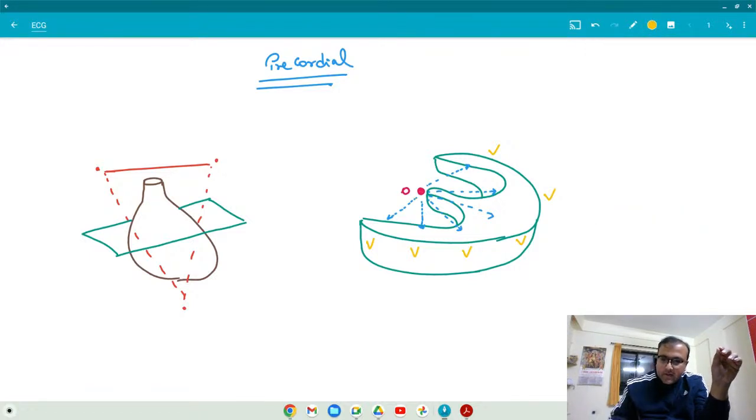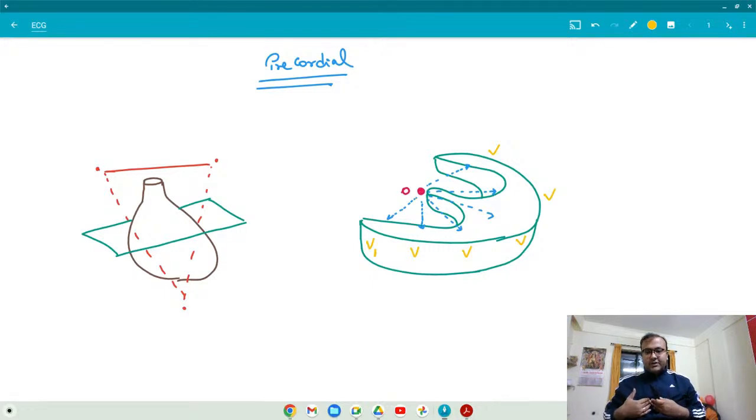So usually V1 is placed at the right edge of the sternum. Okay, so this is the sternum, this is my sternum. So right edge of the sternum at the fourth intercostal space. Then V2 should be placed just over here. That is the left edge, same level, fourth intercostal space, but left edge of the sternum. Then next one comes up V3.